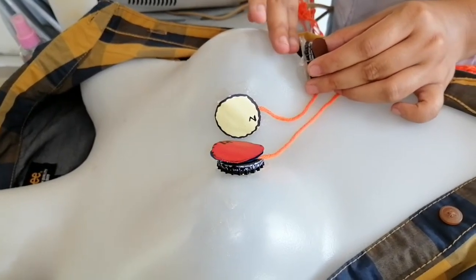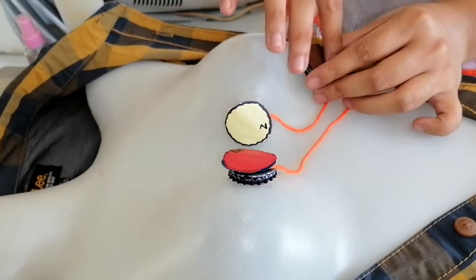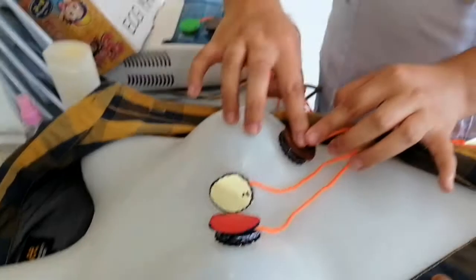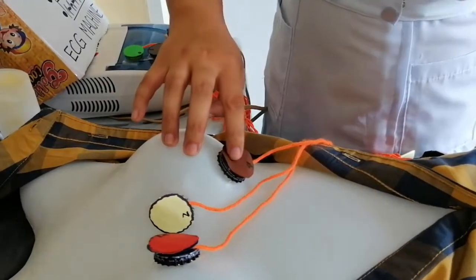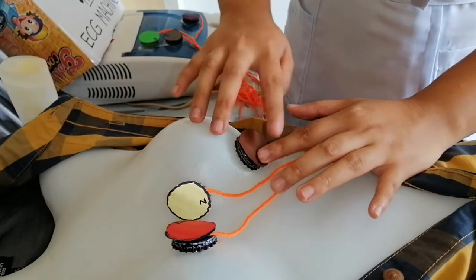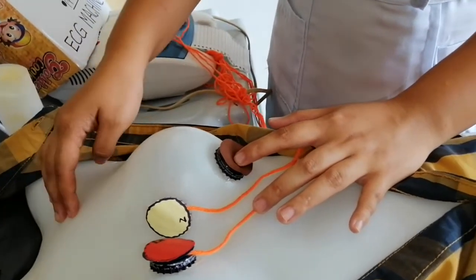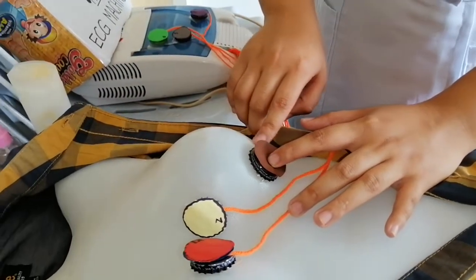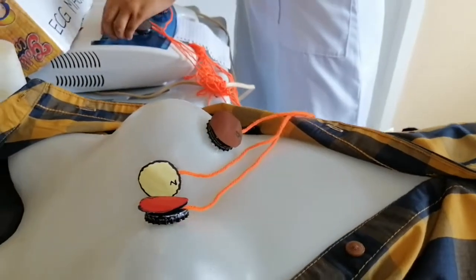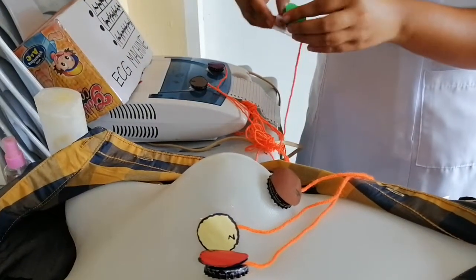For those with big breasts, we really need to lift it so that we can place the electrode. We need to remember that the location of the V4 is very important to take note of, because it is the fifth intercostal space, mid-clavicular line, the apex of the heart, that will view the anterior part of the heart. And after doing such thing, we're now ready to place the V3.